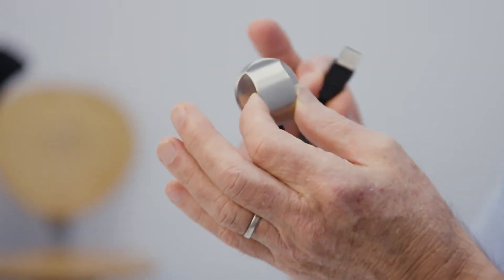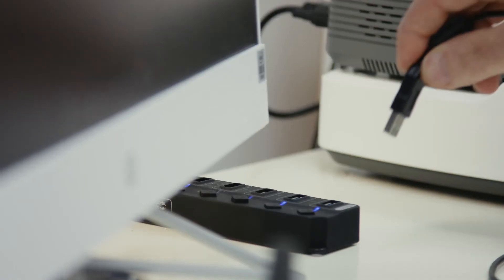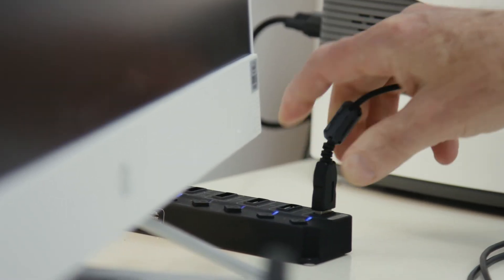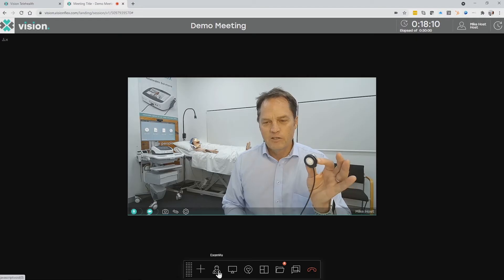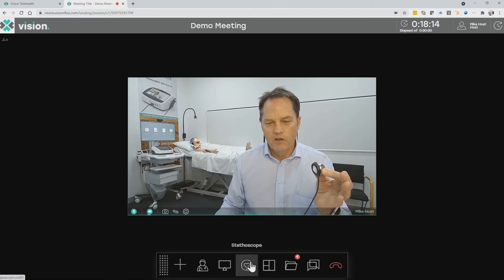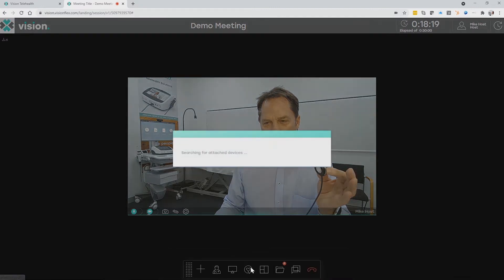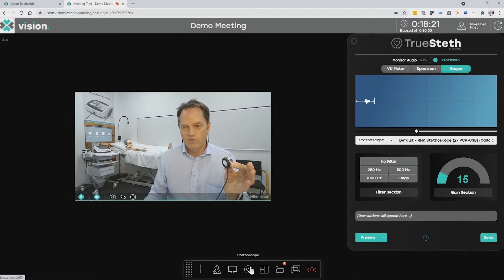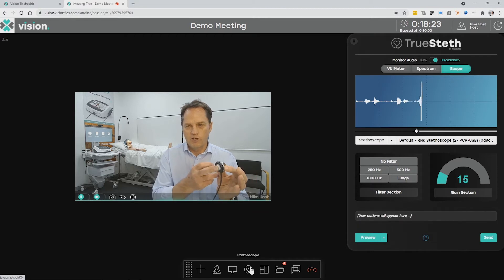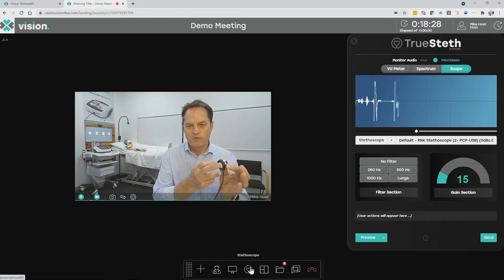Today we're going to be using this USB stethoscope and I'm going to plug that into the PC. To start the stethoscope examination I click on our TruSTETH icon, which brings up a window on the screen showing me the trace through the stethoscope, and I can see that very clearly coming through.